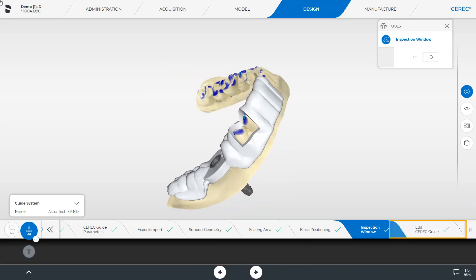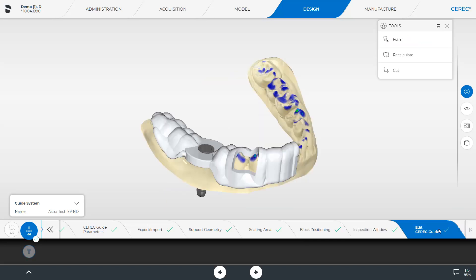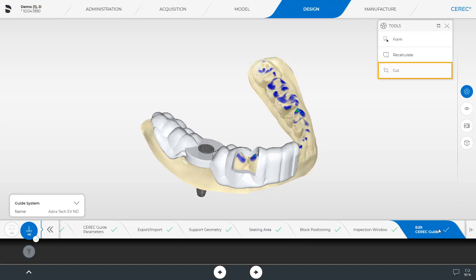Here, three tools are available: Form, Recalculate, and Cut. We will take a closer look at both the first and the last tool. First, we cut off extra areas of the guide. This tool works in the same way as you are used to from other steps and phases.